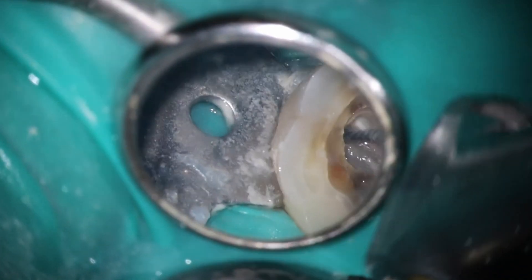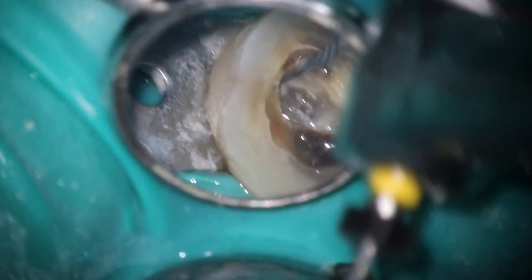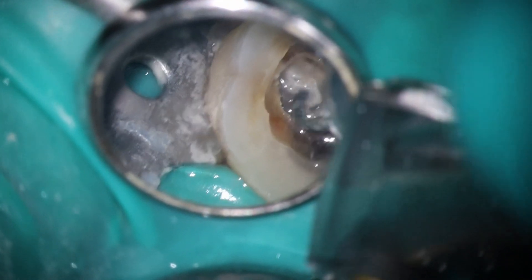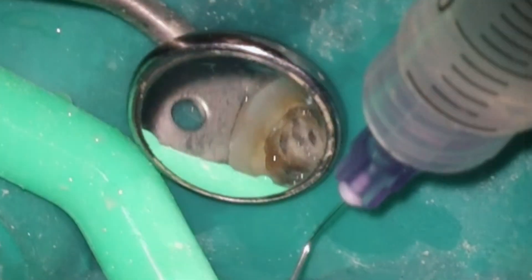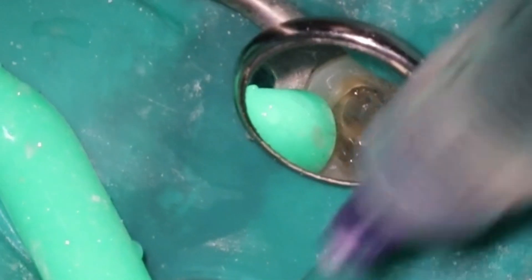I'll start off with the palatal, which is wide open. You can see it drops down beautifully with that 20.06 — no surprise, it's the largest canal and you can see it pretty obviously on the cone beam. Going in now with the MB1, it did buckle a little bit; the tooth is calcified so that's not surprising. I'm only really using the file in the first few millimeters anyway. I'll peck around where the distal buccal is and I actually picked it up nicely. You can use your rotary file in a pecking motion and that will often open up the canals really nicely.